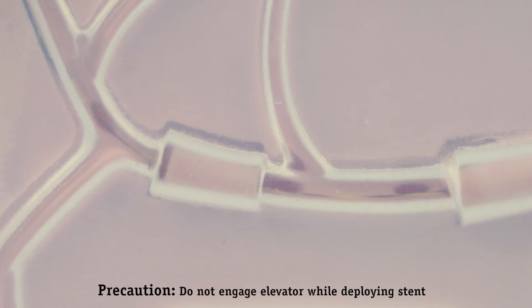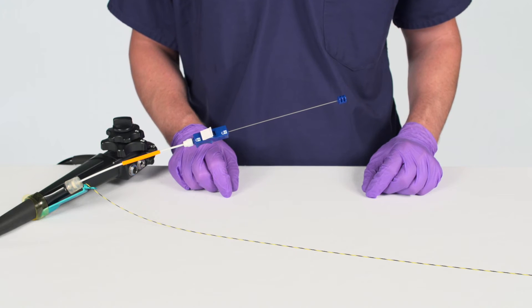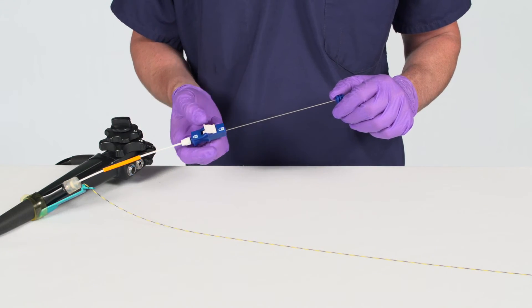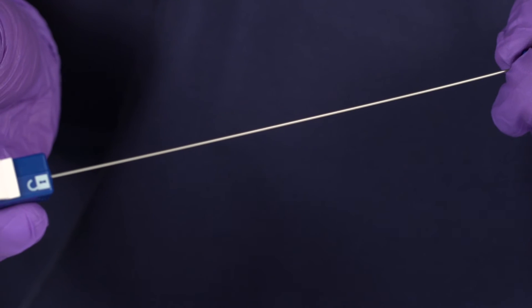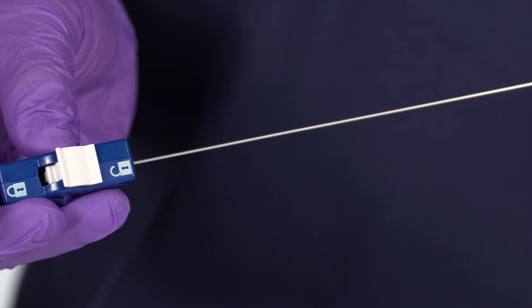Continue advancing the delivery system until the endoscopic marker on the trailing end of the stent remains visible outside the papilla. To initiate deployment, ensure the Naviflex RX Delivery System Locking Mechanism is unlocked. Retract the guide catheter by pulling on the pull wire cap. The stent will be released when the guide catheter RO marker is aligned with the push catheter RO marker.